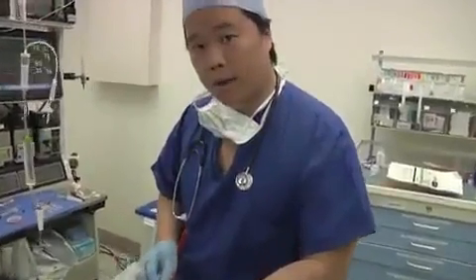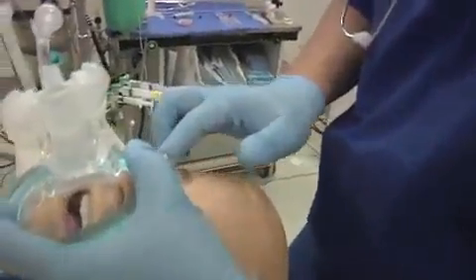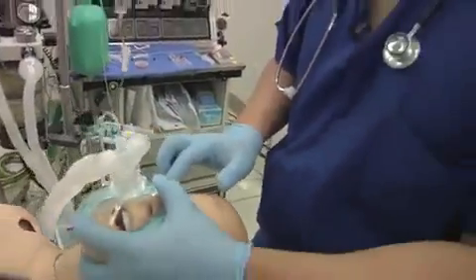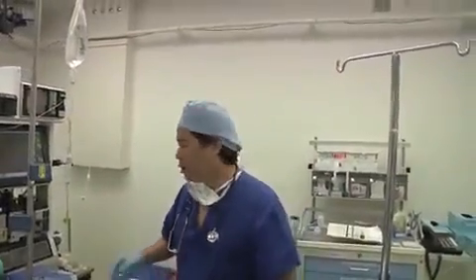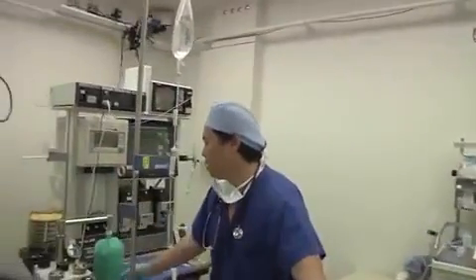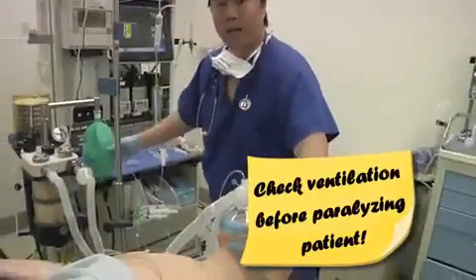Now, to confirm that, you can also check for lid reflex by simply brushing your finger against the patient's eyelashes. And if you see no reflex to that, then that means that the patient is adequately induced for anesthesia. All right? So we're going to go ahead now and give a quick breath just to make sure that we can ventilate the patient, and we can.